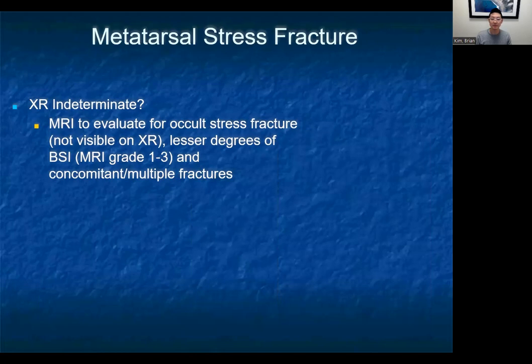That's important because, with both traumatic and stress fractures of the metatarsal, it's very easy to have multiple fractures, especially of the second, third, and fourth metatarsals.